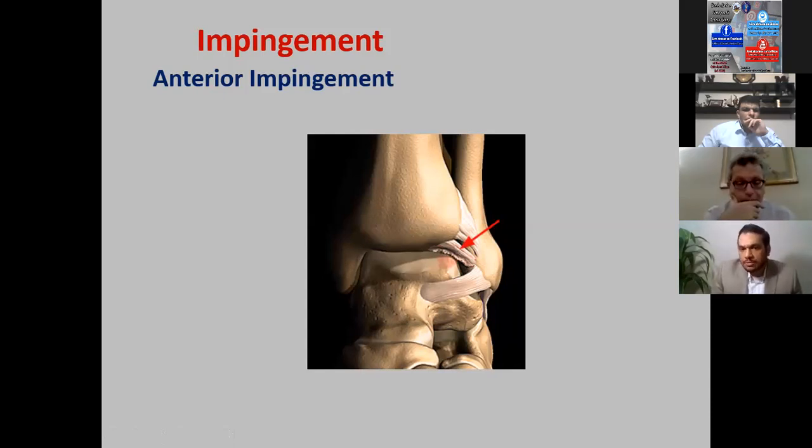We know that chronic lateral instability increases the chance of this band of the ligament coming in contact with the talar bone. And we used to consider this a persistent cause of pain and resect it in all cases. But nowadays, it's considered a normal finding to find this band coming in contact with the talar bone during arthroscopy, and should be excised only if very prominent, or if it gets bent over the talar bone during the maximum degrees of dorsiflexion.